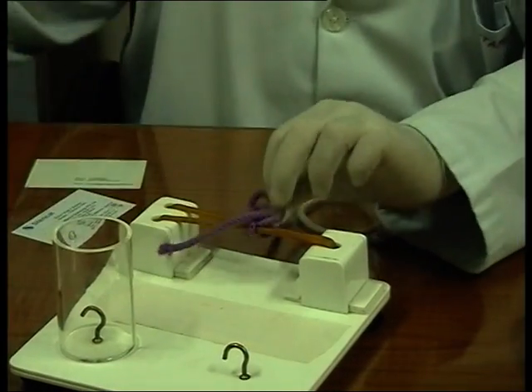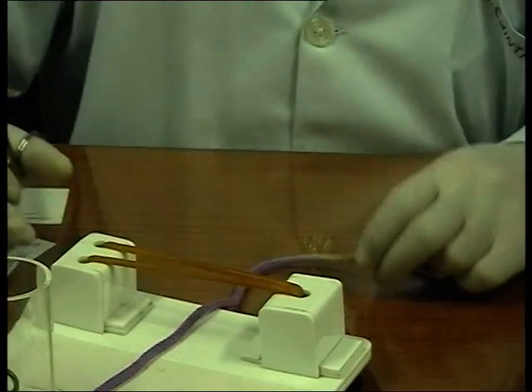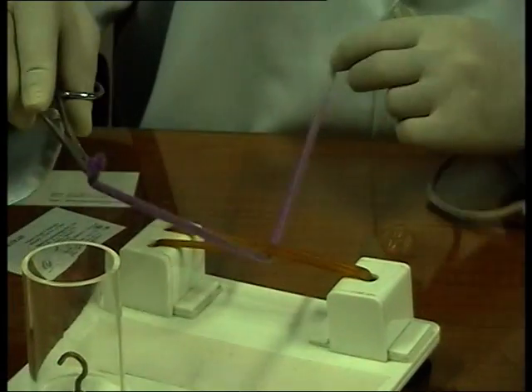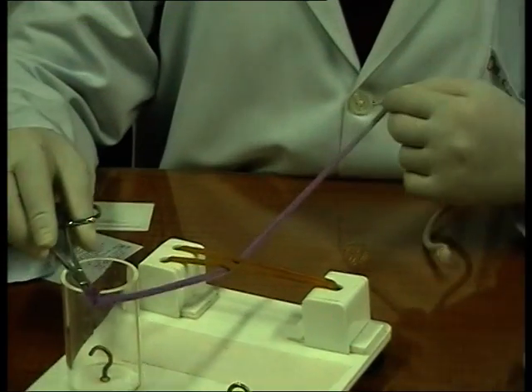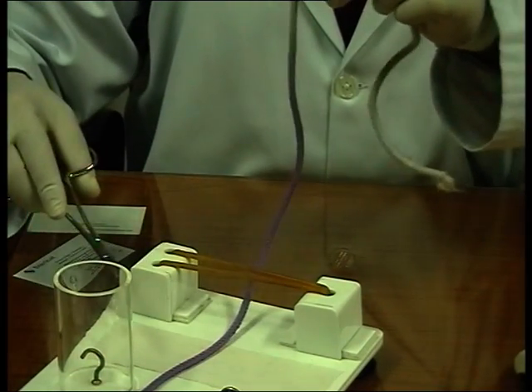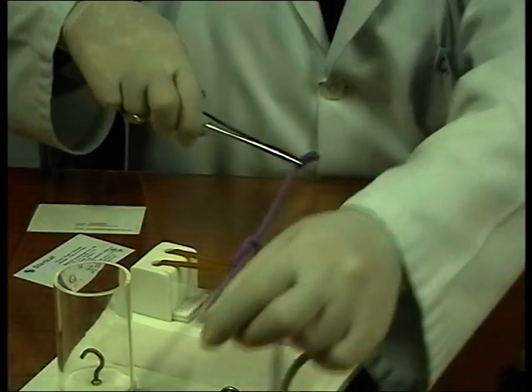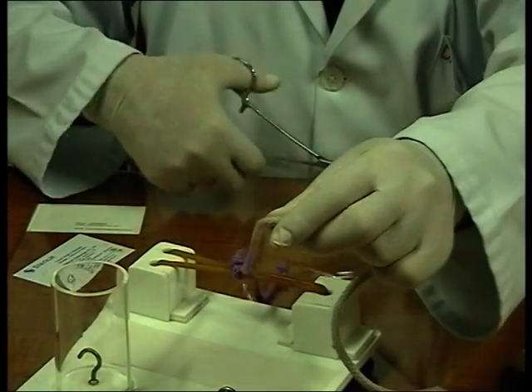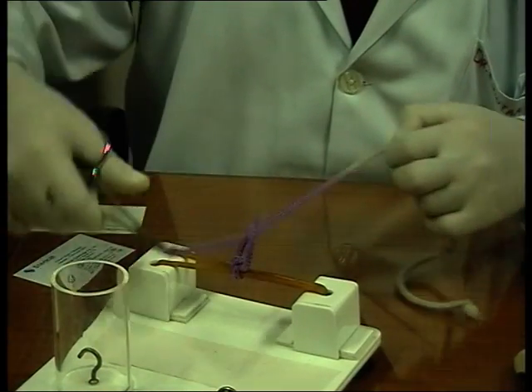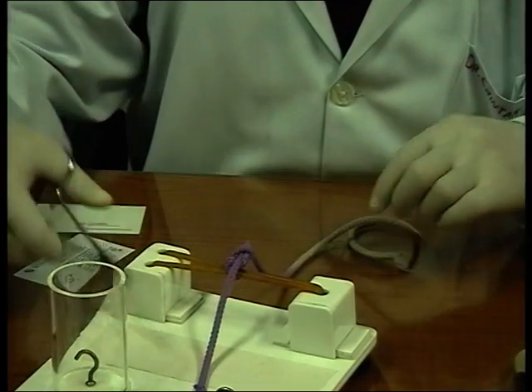Now the other thing is, there's nobody holding it, you just imagine this V. Now that's the V. Imagine it. Because it's just for teaching that I'm giving you that V. The V doesn't exist. Now that's the V. I can make a V anyway. Now I'll take this throw and cross. Once again, that's my V. I'll take this throw and cross back. That's a reef knot. Clear?